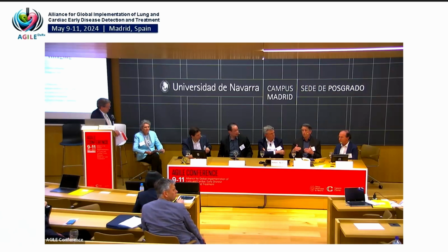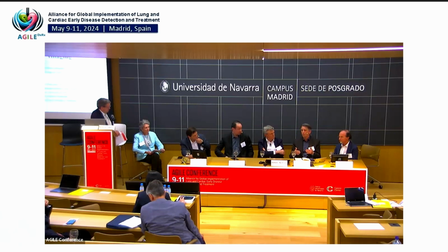There are a number of approaches trying to model that noise using the noise power distribution to help correct for it. In my hands recently, in developing harmonized protocols for PRECISE, which is an extension of the Severe Asthma Research Program, we were able to get reasonably good performance with model-based IR techniques that helped mitigate some of that noise.